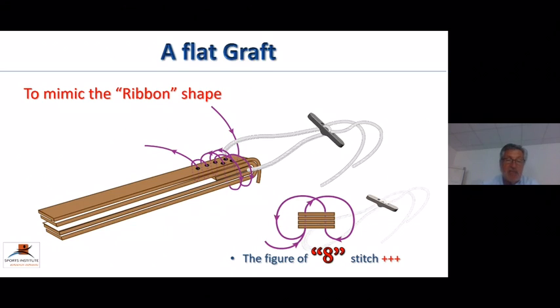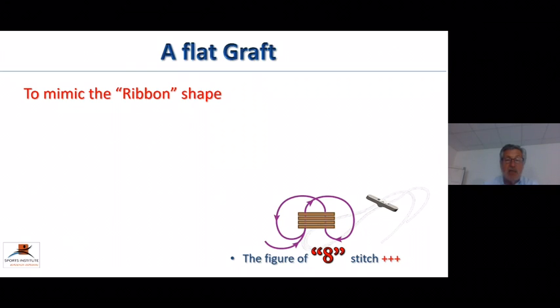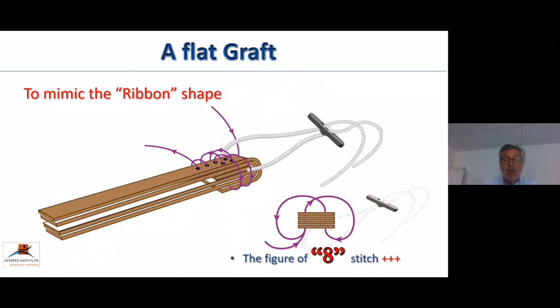But for this setting, don't forget to lock the two extremities of your graft. As you can see, you need to grab the two extremities with your figure of eight stitch. You see?